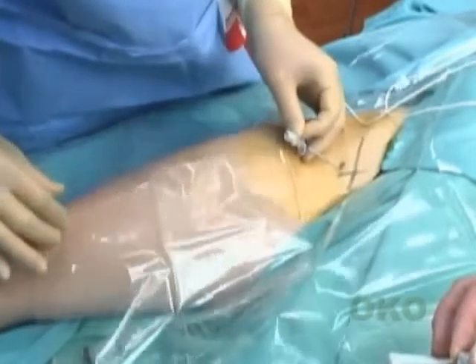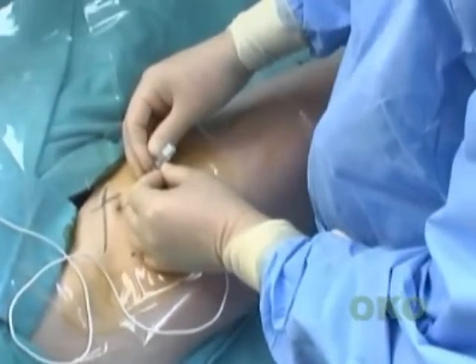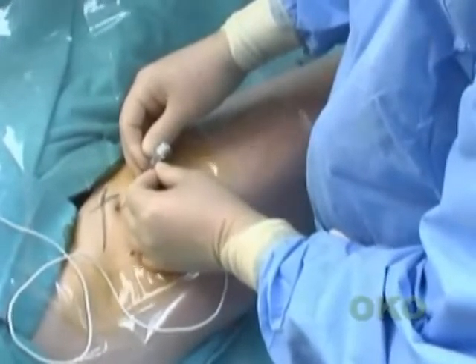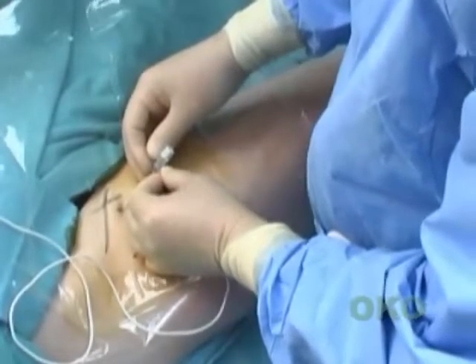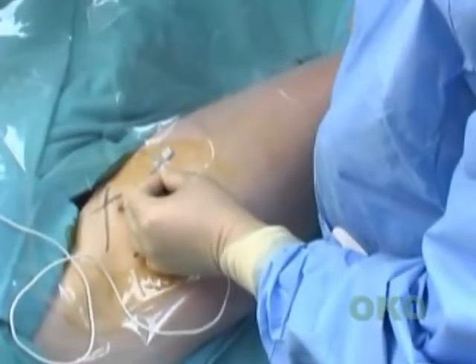Notice the 2 pops as the fascia lata and iliaca fascia are penetrated, and notice the cephalad movement of the patella as the femoral nerve is stimulated. The nerve stimulator output is turned down to between 0.3 and 0.5 milliamps, and a brisk motor response of the quadriceps muscle should still be present.